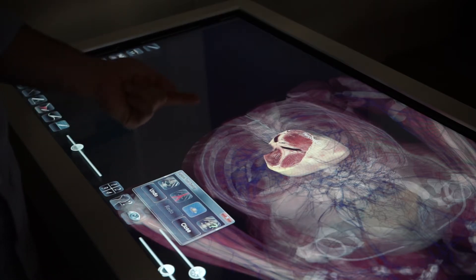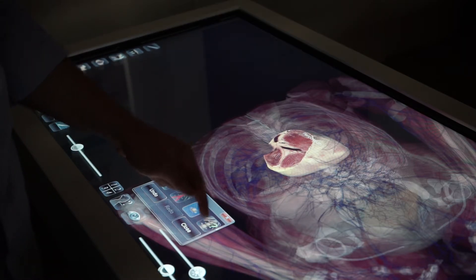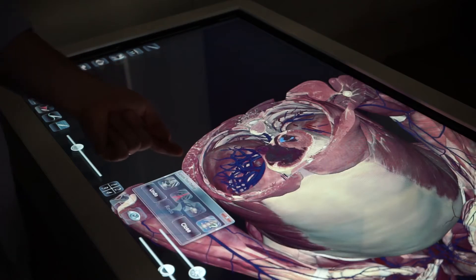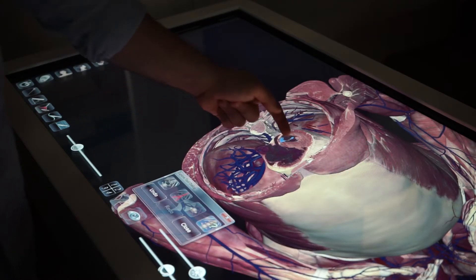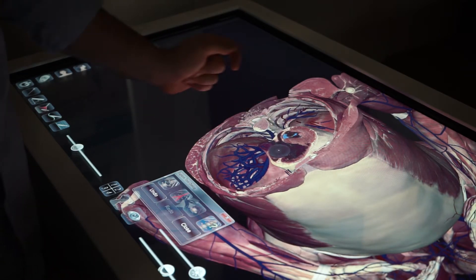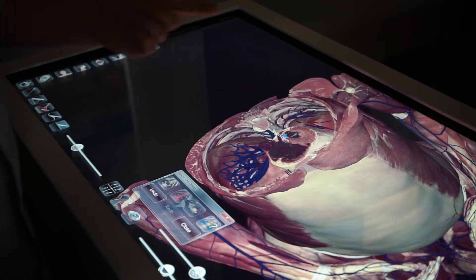To discover the name of a body part, I can select the icon with the spine and a question mark, then tap where I want to label.